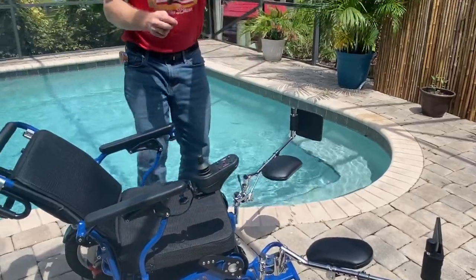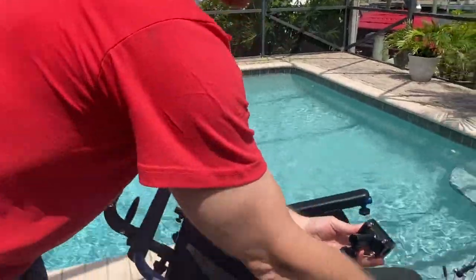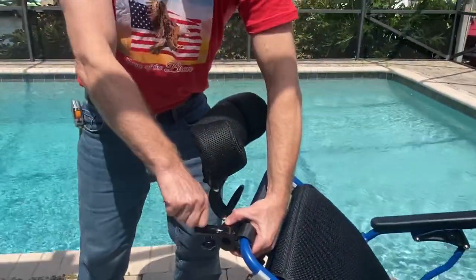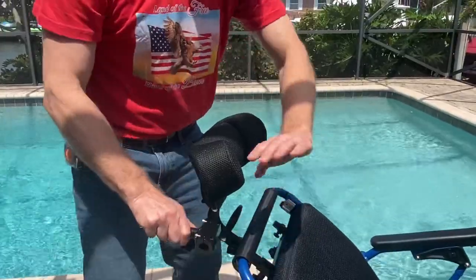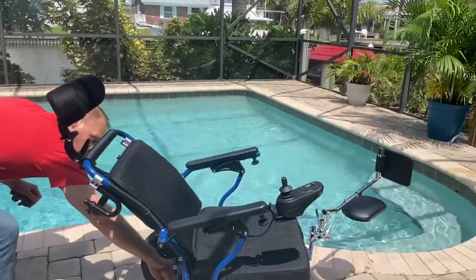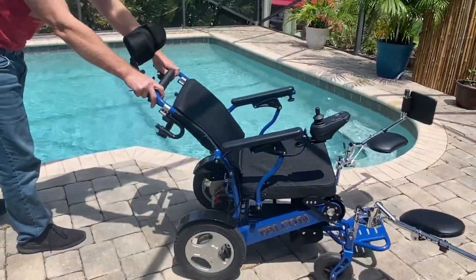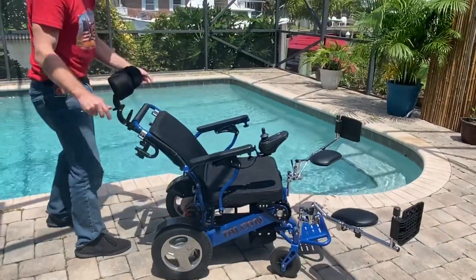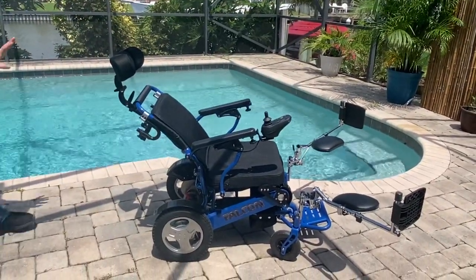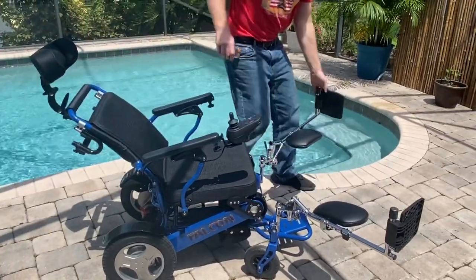I'm going to move the attendant controller bracket out of the way. This is an optional bracket that would allow you to mount the joystick on the back of the chair so an attendant could control the chair without having to push it. The chair does have the ability to go into freewheel mode, or it functions as a power chair. Let's lock it so it functions as a power chair.